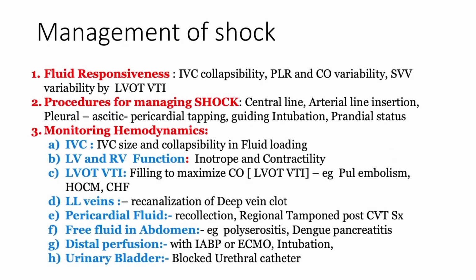So management: fluid responsiveness by IVC collapsibility, VTI variability, procedure management, how to insert lines under ultrasound guidance, and monitoring. Monitoring, most important, is that everything is dynamic. As you give fluids, as you give everything, you can see the changes occurring in the heart. An empty heart starts filling up. You give your dobutamine, a poorly contracting heart will start contracting better. So you can see a real-time insight into what your medication is doing.